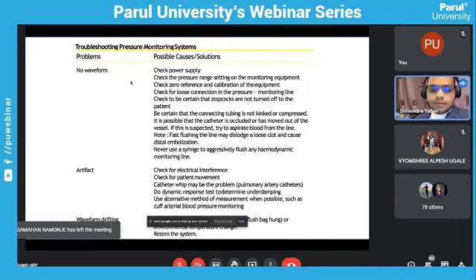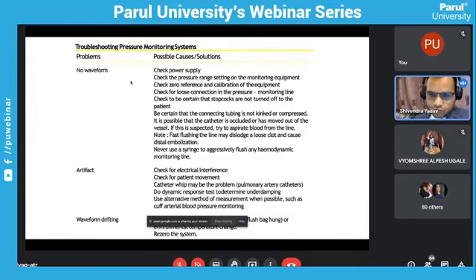What happens when you flush it inside? If it is a clot, that will go inside the patient's heart. It can go anywhere in the system. It can go to the lungs, it can go to the coronary arteries, it can go to the brain, any other organ. Okay? So it is very important not to flush inside. You have to aspirate it outside. You have to do the suction outside.